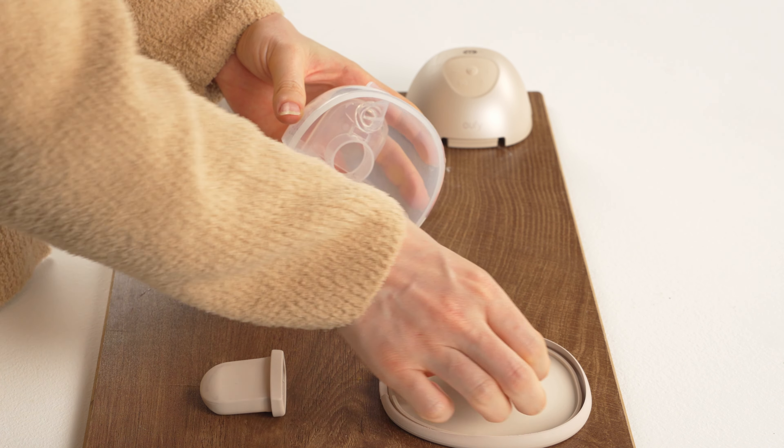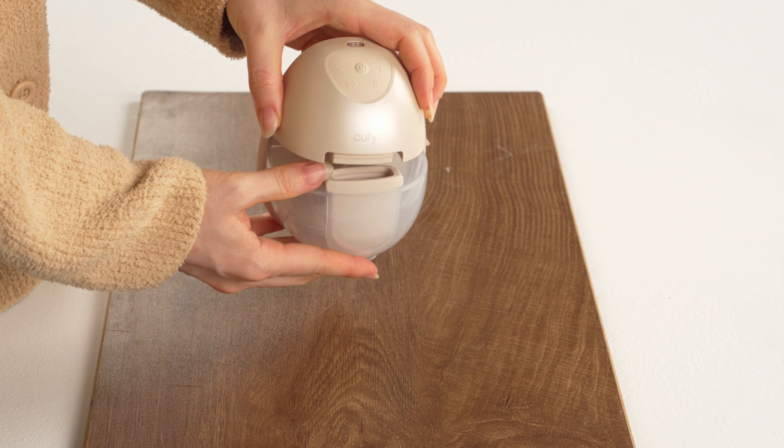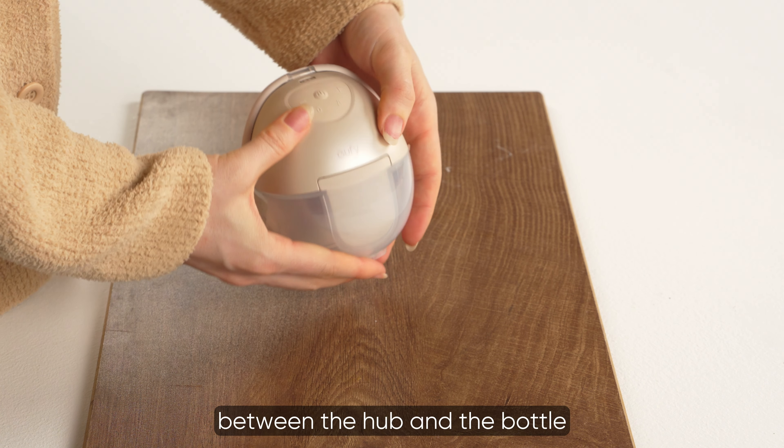Insert the diaphragm into the groove of the container with the concave facing inwards. Install the hub on top of the container and push firmly to seal the gap between the hub and the bottle.